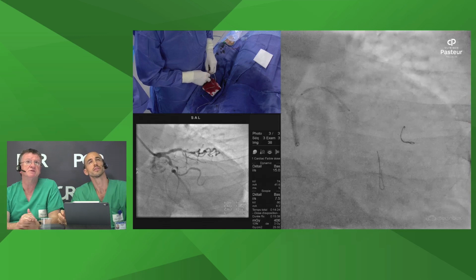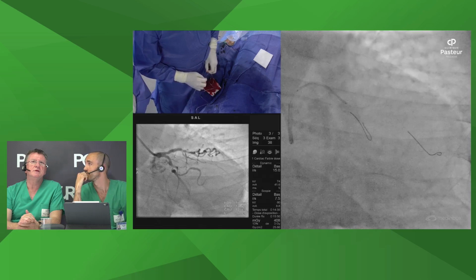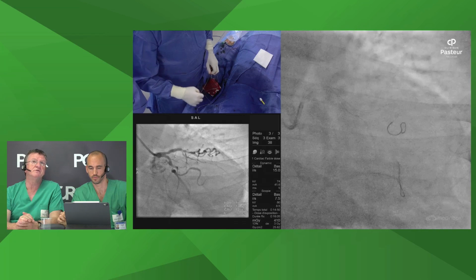But an anchoring maybe, a bad idea because of a higher pressure with the OM2. Yeah. So you could certainly do that because the guiding catheter isn't going to give enough support to deliver this long stent into that vessel. And I think it's a combination of factors, the circumflex. So what we can do is to take an additional balloon inflation.